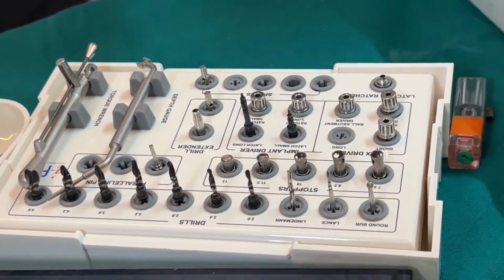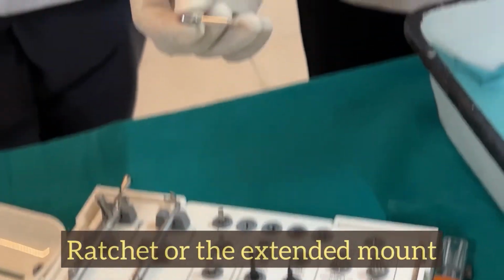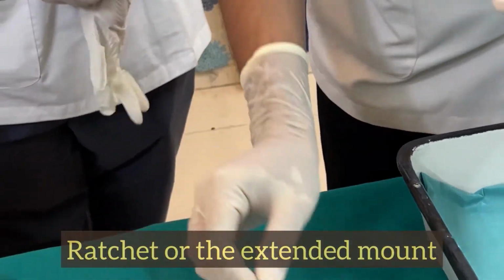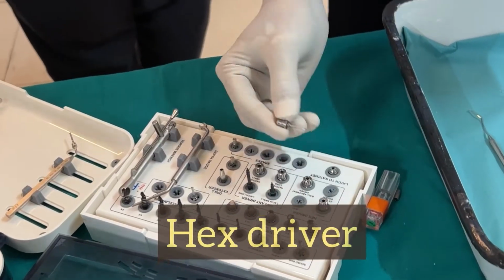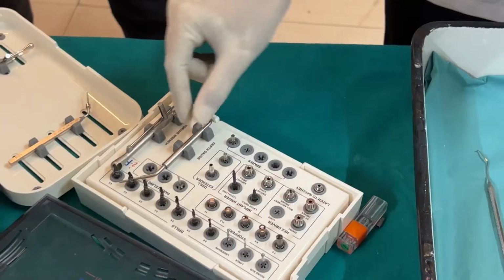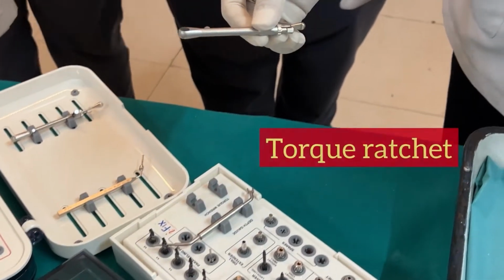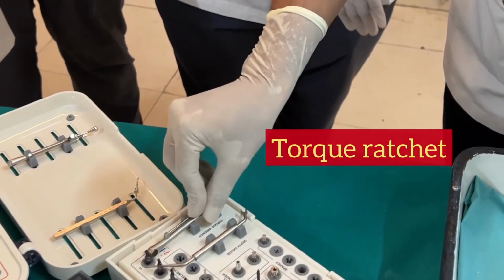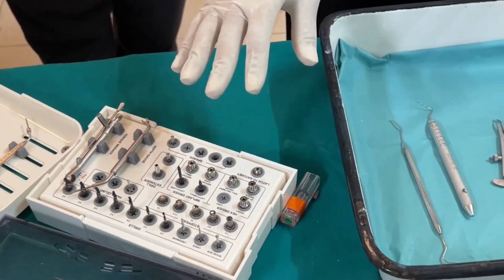Which were the other components? We used to have the ratchet or the extended mount, which used to be attached to the ratchet, and we used to have the hex driver. The hex driver is again for placement of the cover screw. And what else was there? We used to have the depth gauge and the most expensive component, the torque ratchet. A detailed discussion of all these components we had in the first video. Here I will only be demonstrating.